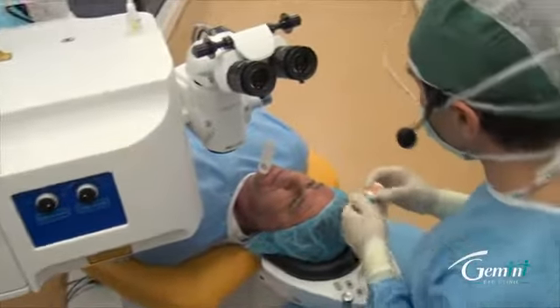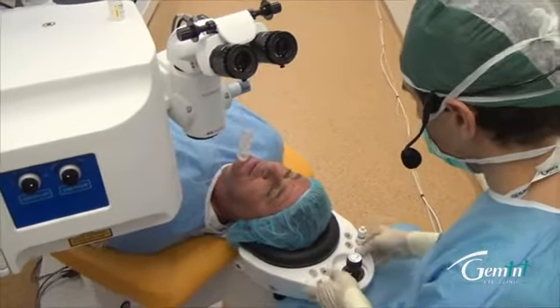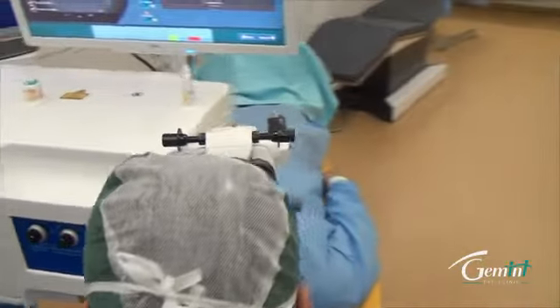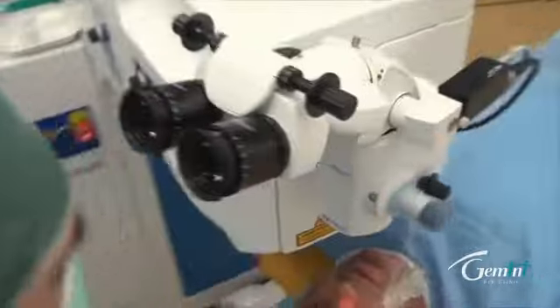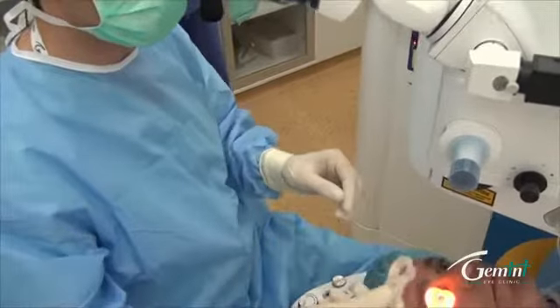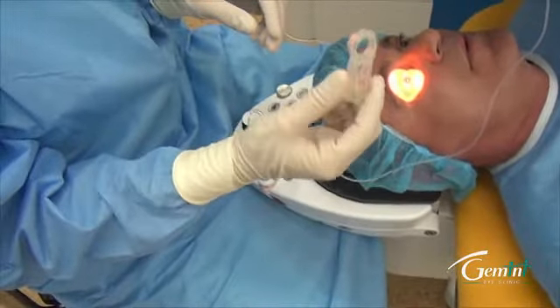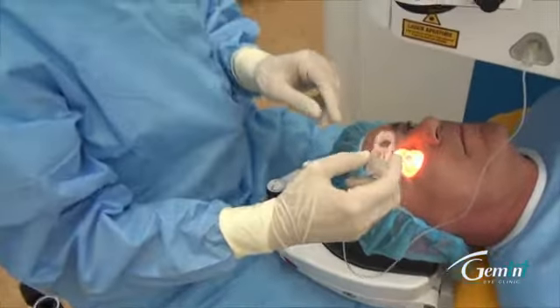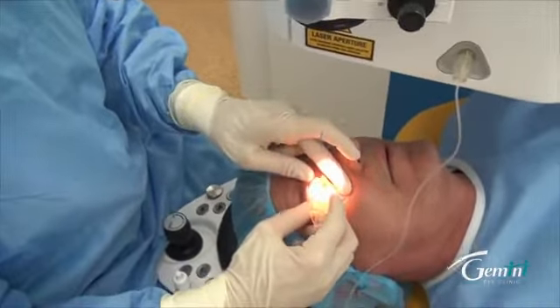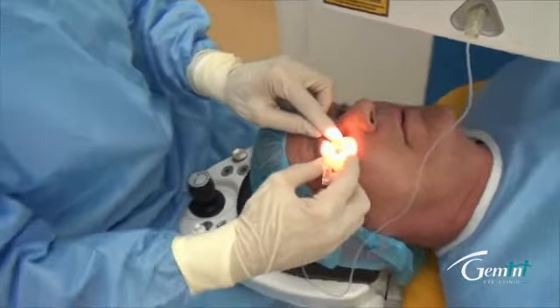I'm going to give you one more drop to your eye. I'm going to move you under the laser, where there will be a bright light, and please keep looking straight into the bright light. Straight into the bright light. And I'm going to touch your eye with this disposable suction ring of the Victus femtosecond laser device. So while the patient is looking at the light, I'm just going to touch his eye with this suction ring.